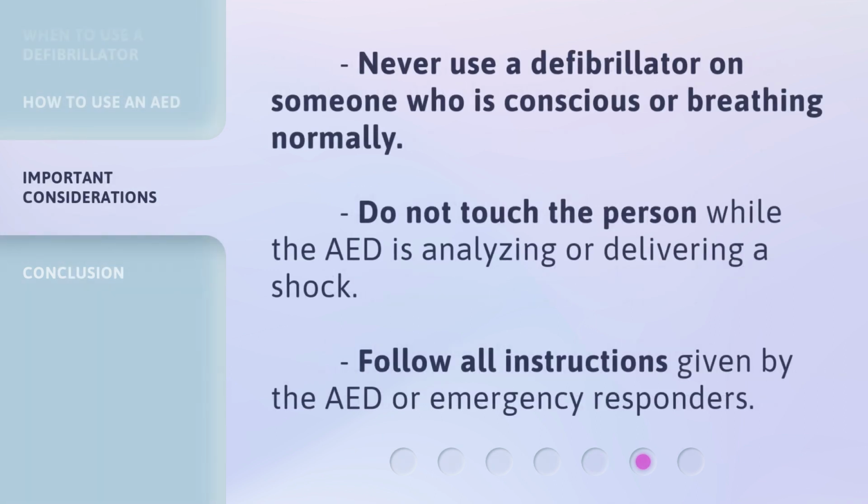Never use a defibrillator on someone who is conscious or breathing normally. Do not touch the person while the AED is analyzing or delivering a shock. Follow all instructions given by the AED or emergency responders.